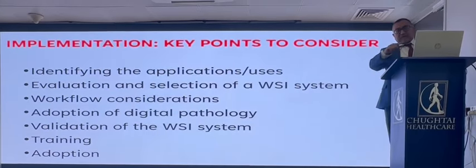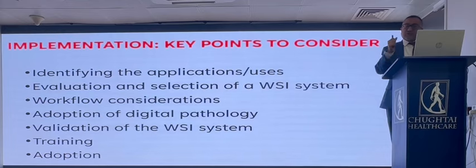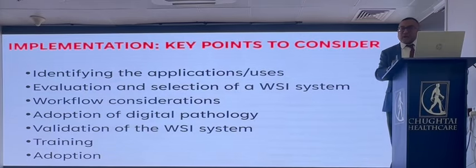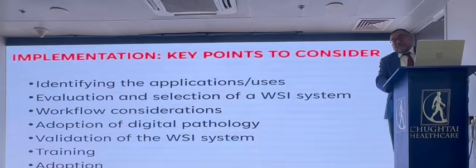This PowerPoint will be available to you, by the way, so make good use of it. Make good use of the blank check that you have. Ask the right questions: workflow considerations, adoption of the system, validation. Make sure you have buy-in from your pathologist.